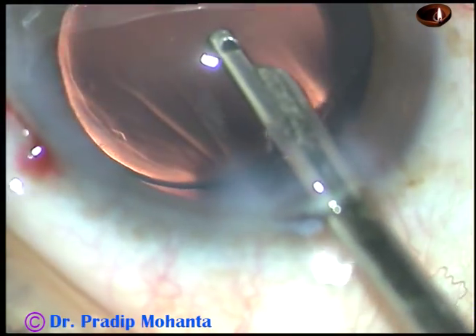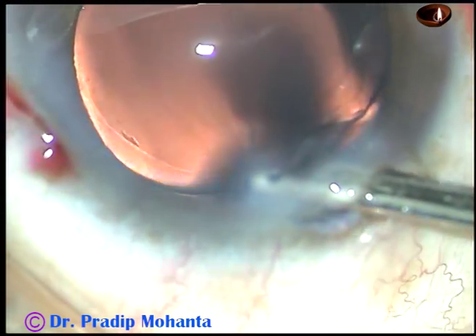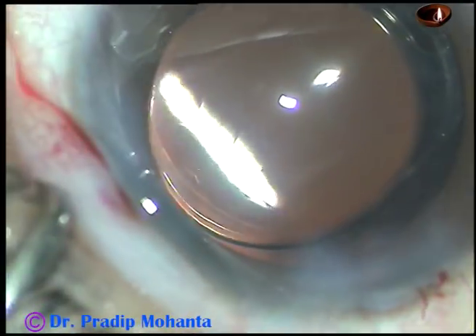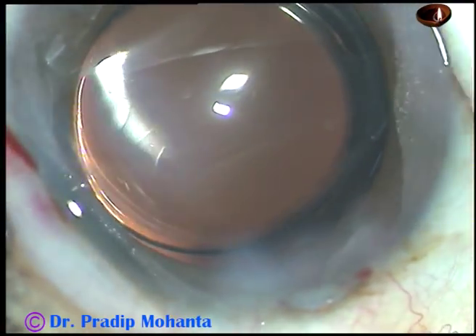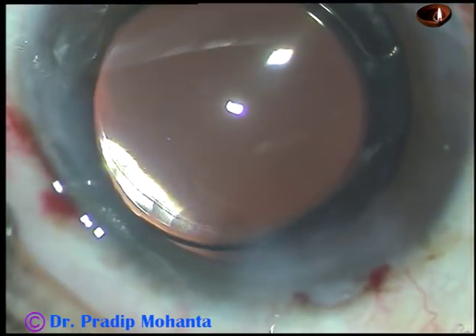And now the anterior chamber is nicely formed. See how nicely you can form the anterior chamber again by a Simcoe cannula. There it is. And now this is how you check all the incisions. There should not be any leakage from any side.